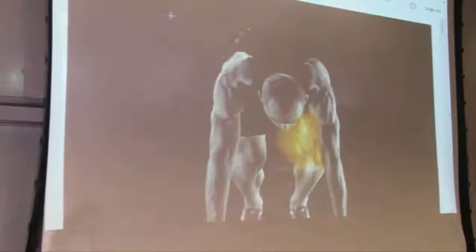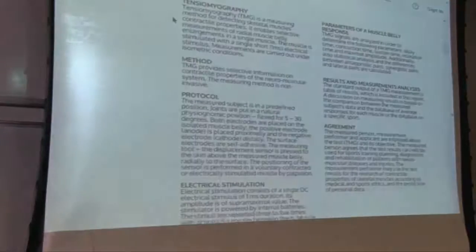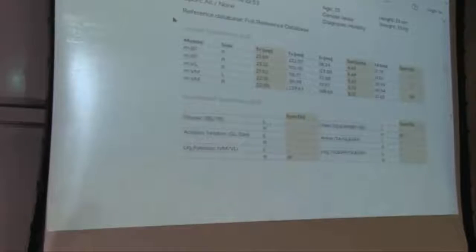So now the data we'll get will be a little bit limited, but what we have here is we measured 5 muscles. We only have one pair: vastus medialis left and right. So the contraction time is almost identical. It's 22 point something. There is a difference in displacement, so the overall symmetry is not very high. But if you just look at the overall symmetry of the contraction time, the speed of velocity, it's almost 100%. And the displacement symmetry is a little bit lower.